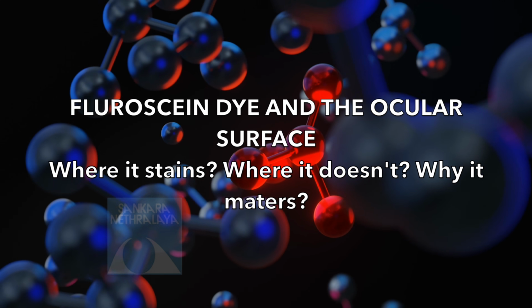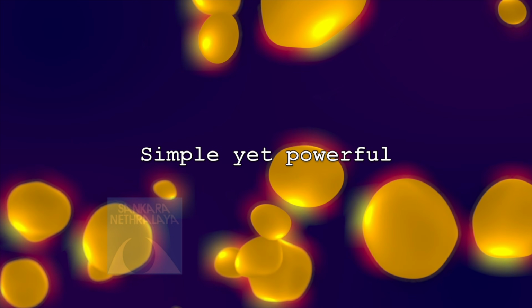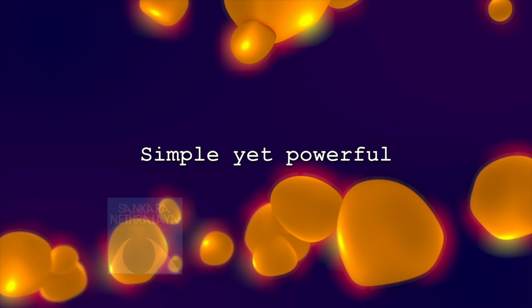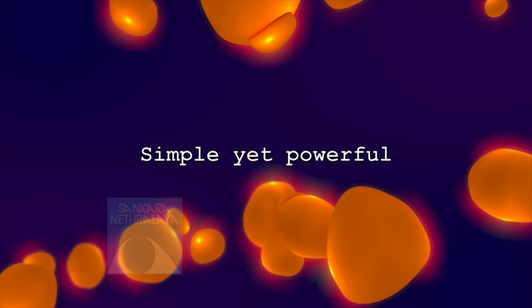Fluorescein dye and the ocular surface. Where it stains, where it doesn't, and why it matters. Fluorescein dye is a simple yet powerful tool for diagnosing a range of ocular surface disorders. In this video, we'll explore the dynamics of the dye, the mechanism, and various clinical applications.